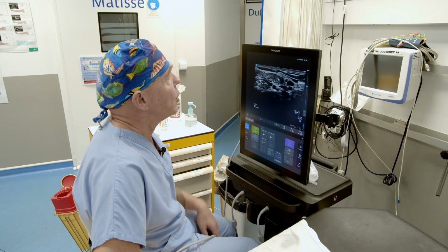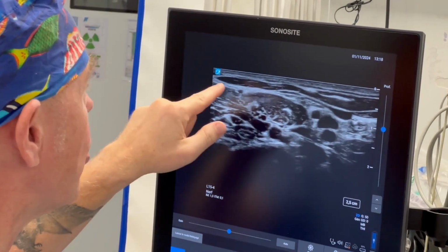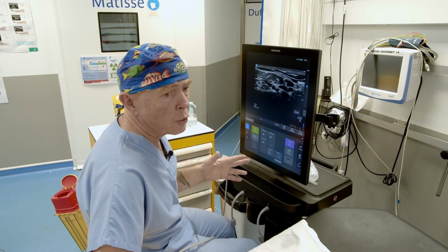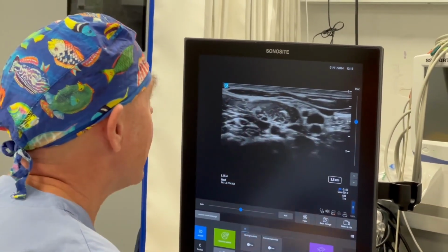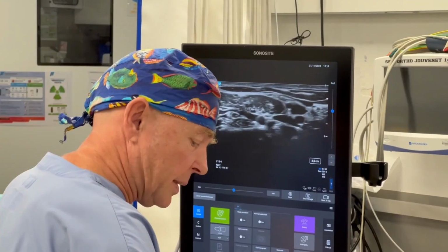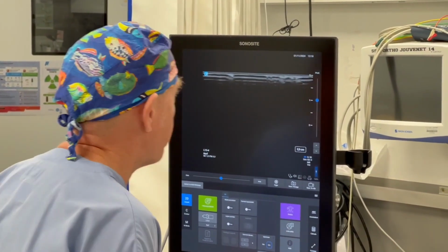But for example, with this trunk level supraclavicular approach, here you can clearly see the anterior scalene, the middle scalene, the superior trunk, the middle trunk, and the inferior trunk. It allows you to perform all surgeries of the upper limb. And if you see that it affects the clavicle a little, you just add 3 cubic centimeters with the same puncture point. And then if you feel that you need to cover the inside of the axillary hollow and the intercostobrachial nerves, which is more of a thoracic component, right after that you can do a PEX.